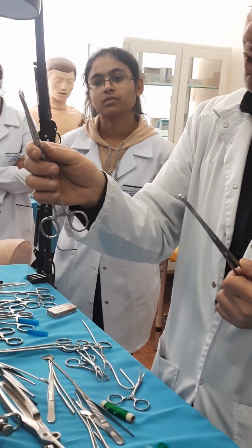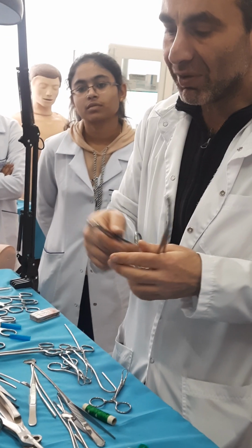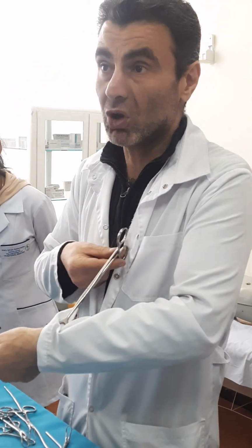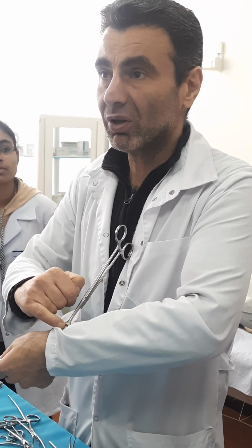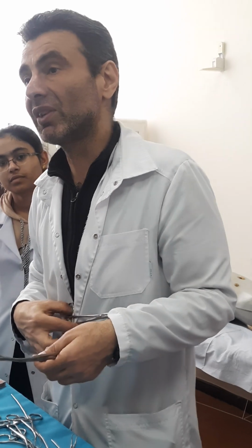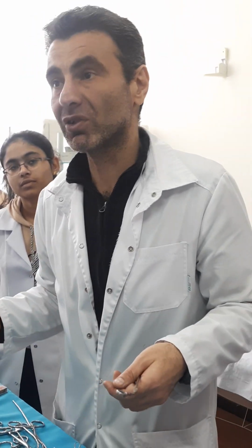They have some aperture. Size and form can be different. What is the main value? Fixation, strong fixation, but protection of the structure which will be inside of the aperture. For example, I cannot fix and strongly press the vascular structures because of the rupture and formation of bleeding.